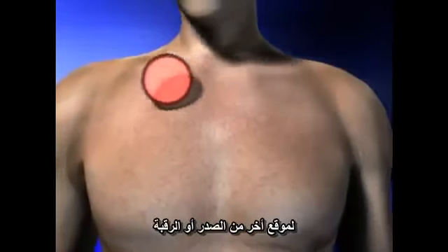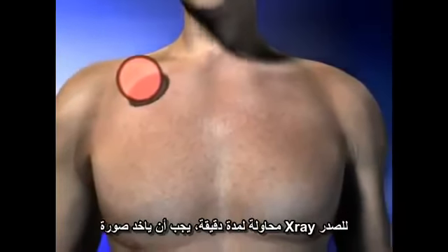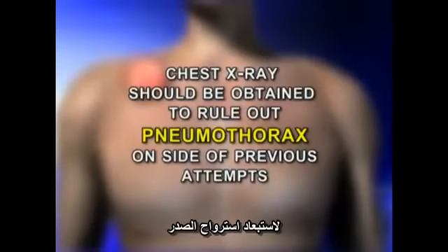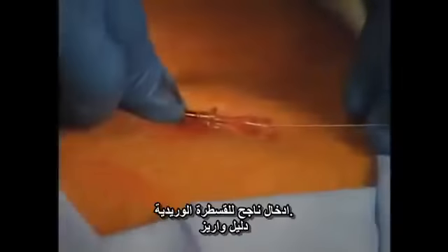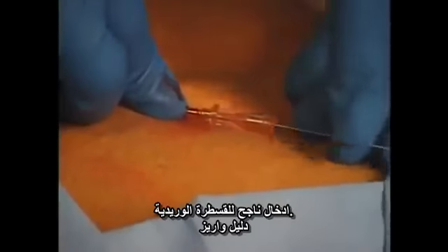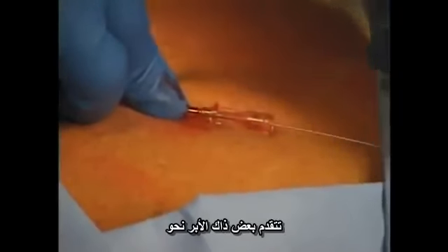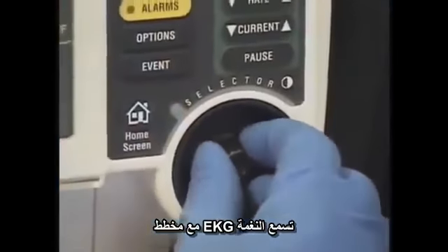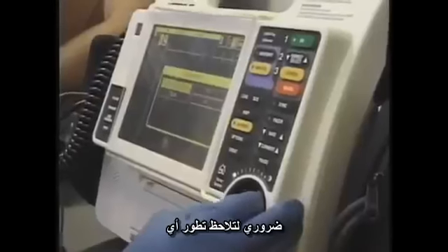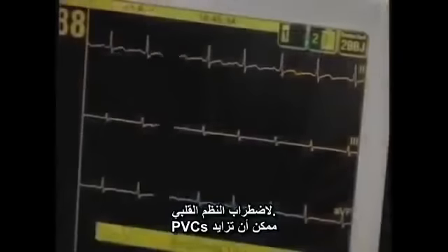Please remember that before switching to another side of the chest or neck for a second attempt, a chest x-ray should be obtained to rule out a pneumothorax on the side of the previous attempt. Of course, certain emergent conditions may preclude this. After successful cannulation of the vein, the guide wire is then advanced through the needle into the vein. At this point, cardiac monitoring with an audible EKG tone is essential to note the development of any arrhythmia.